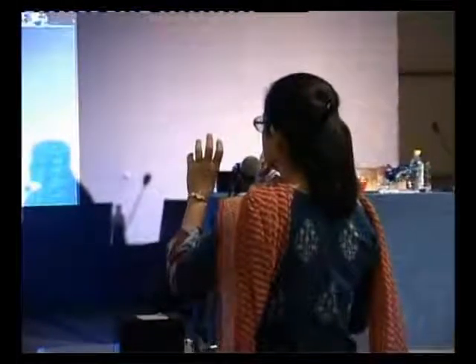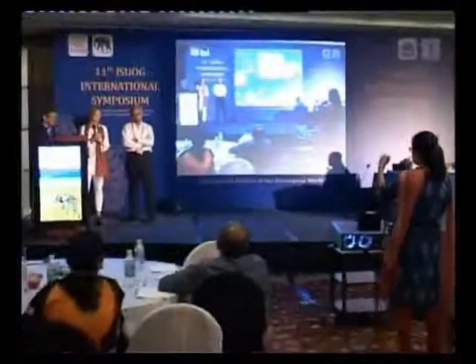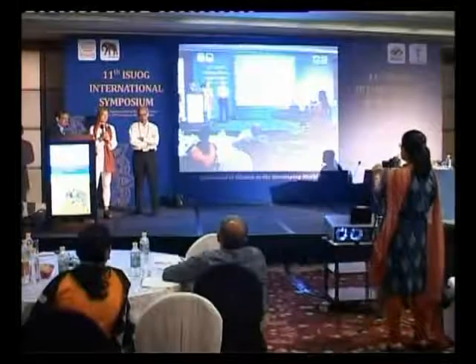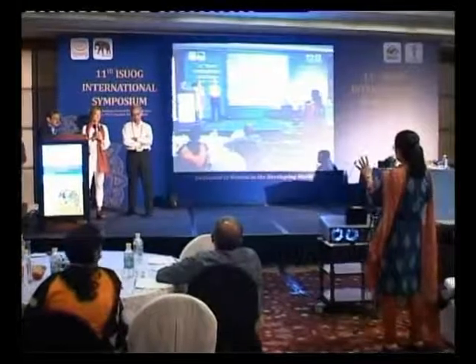This is something I've been doing. I'd like to know what you think. In some cases, I have been instilling gel into the vagina for better visualization of the surface of the cervix, particularly for small early cervical lesions. And then you put on your color Doppler.